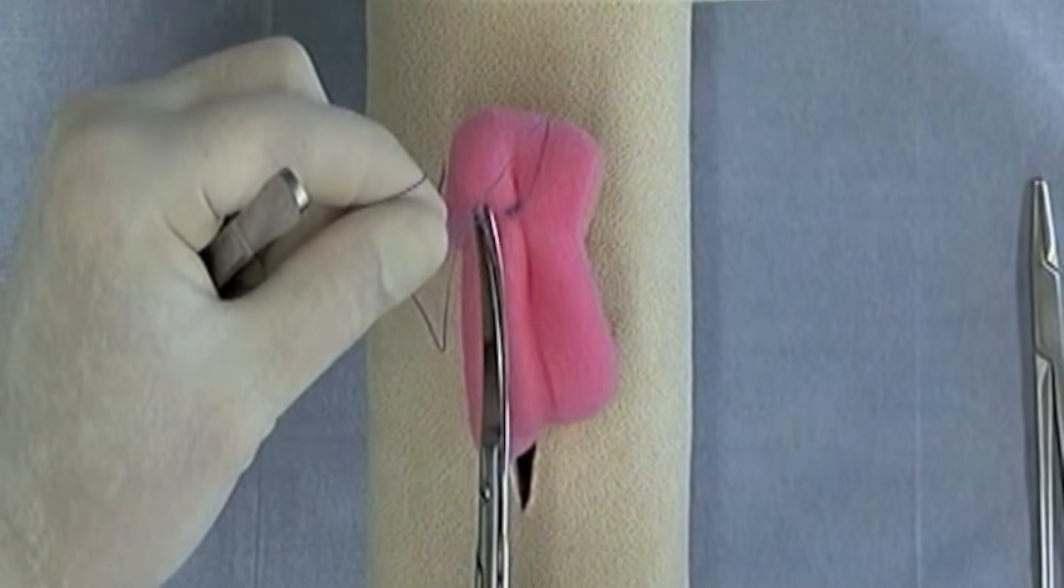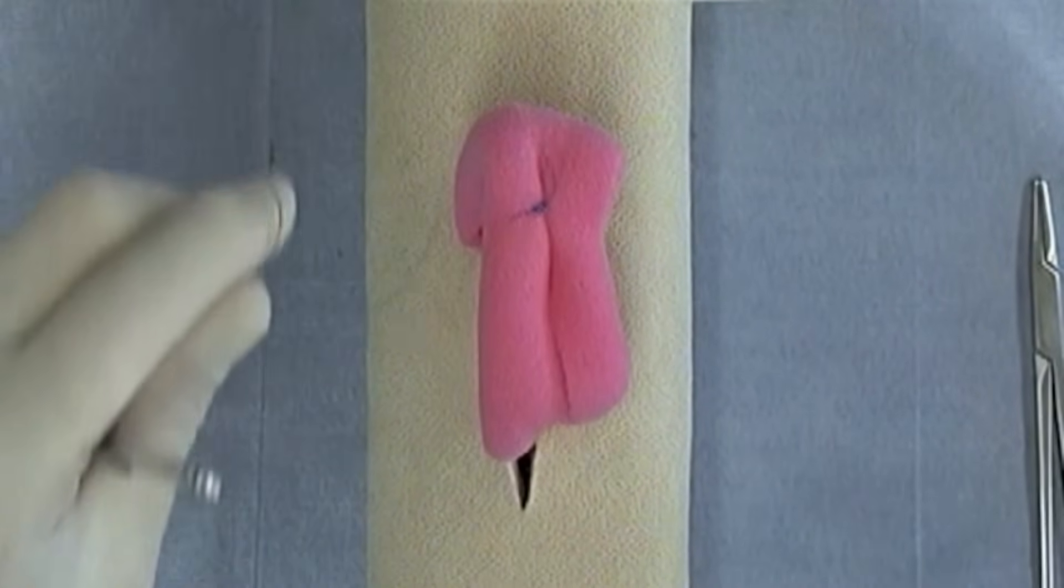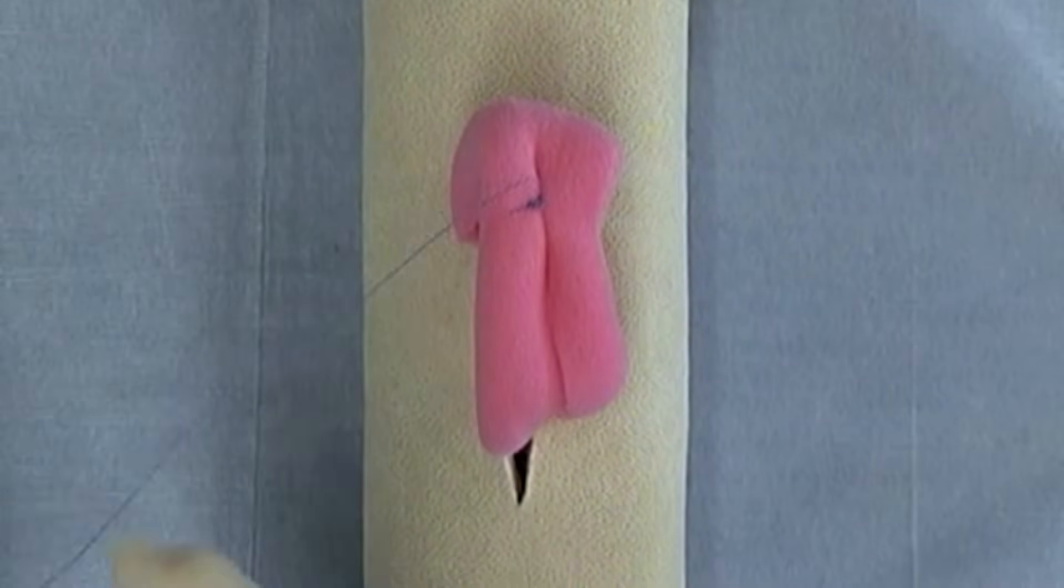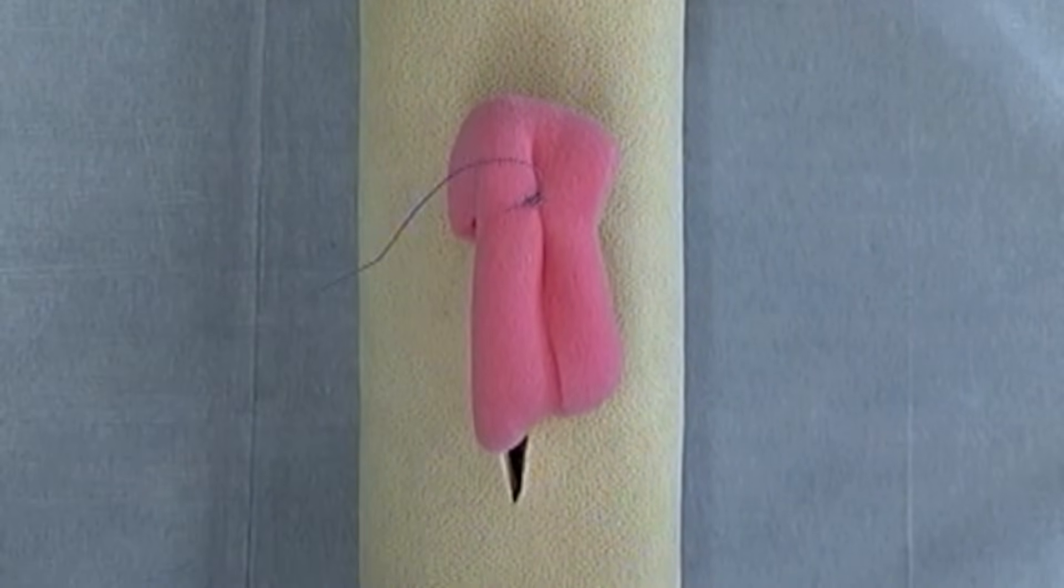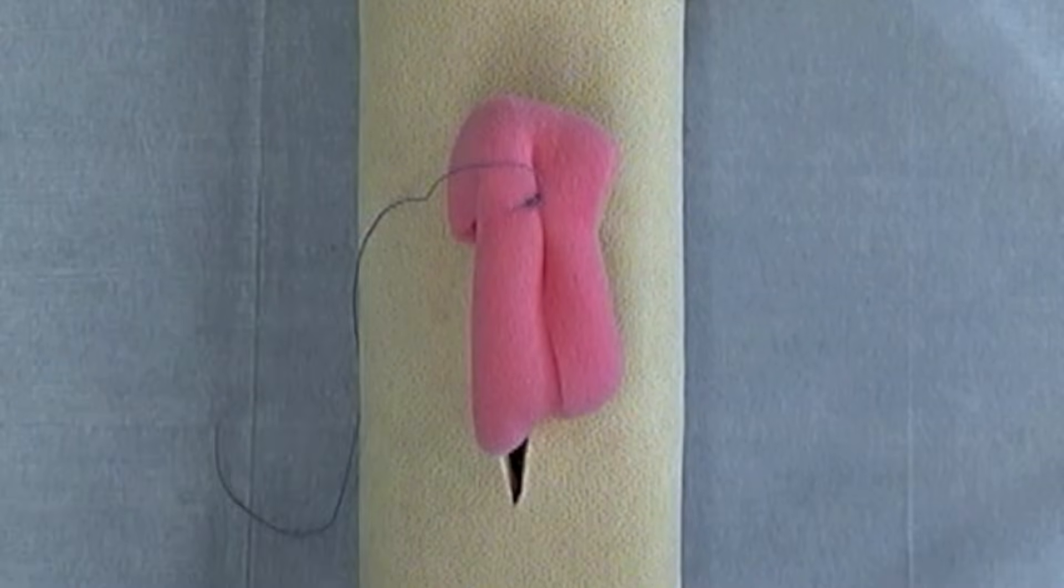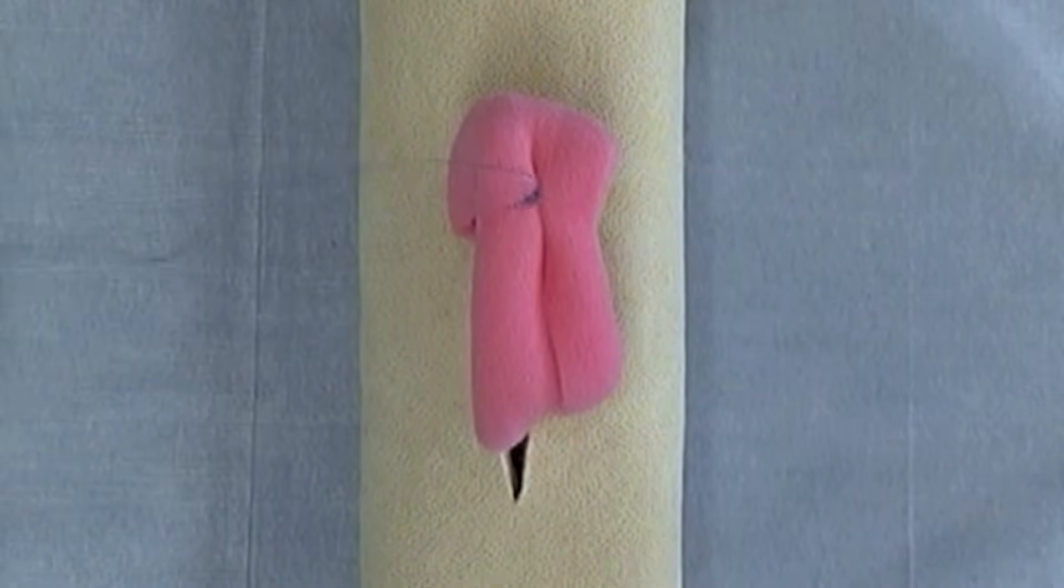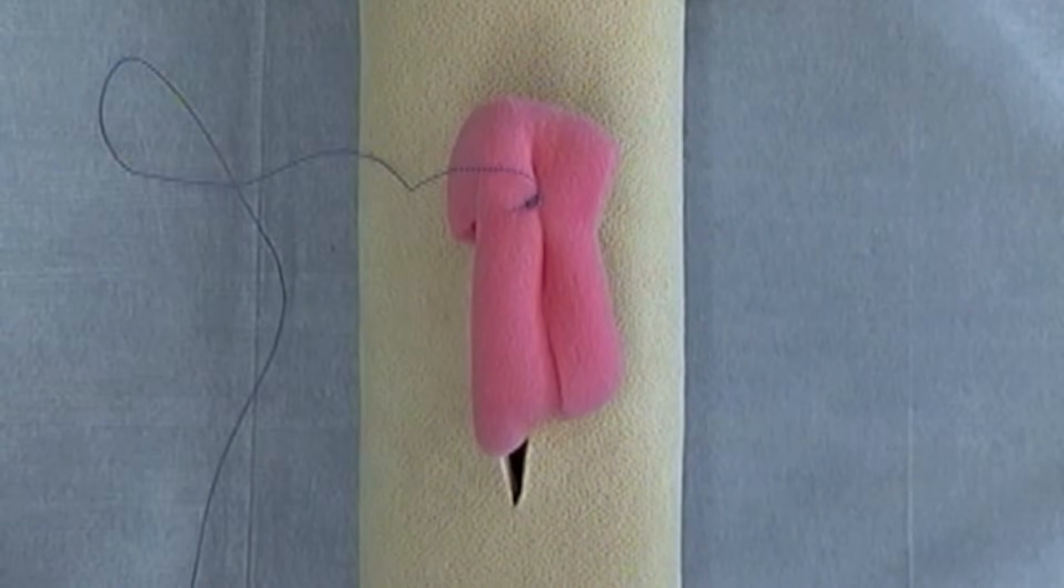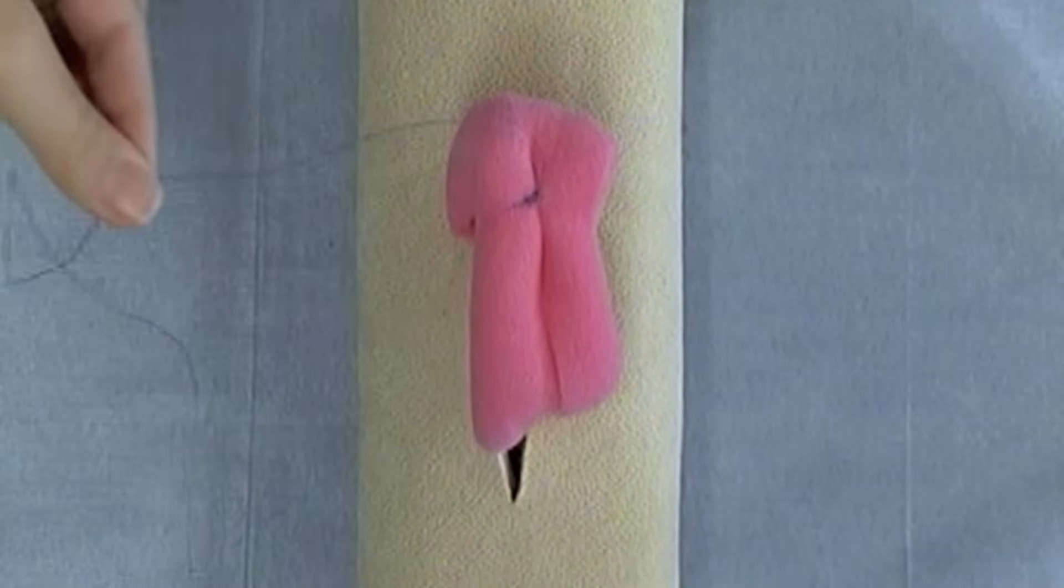So I've created a Lembert suture to start this continuous Lembert pattern. I will use an assistant to maintain even tension on my suture as I construct this continuous Lembert.